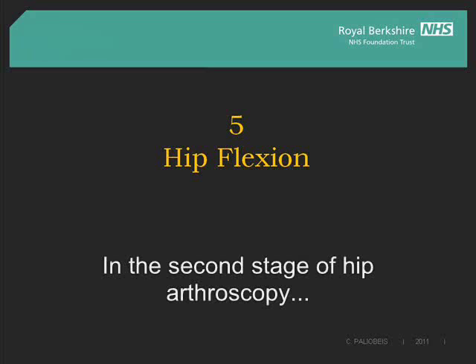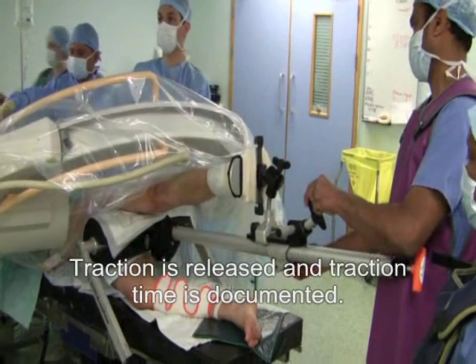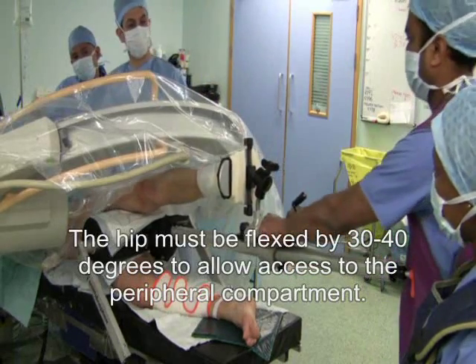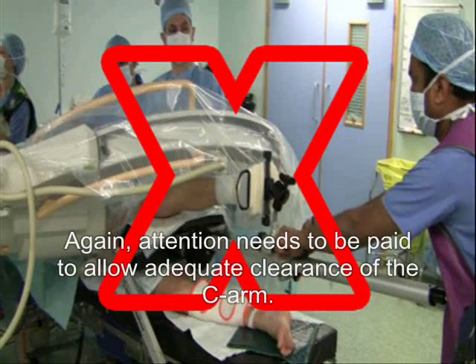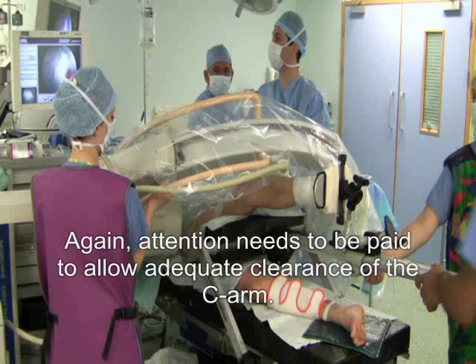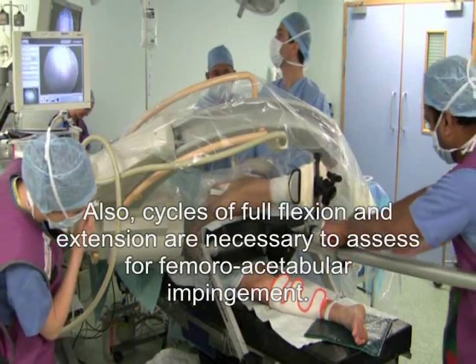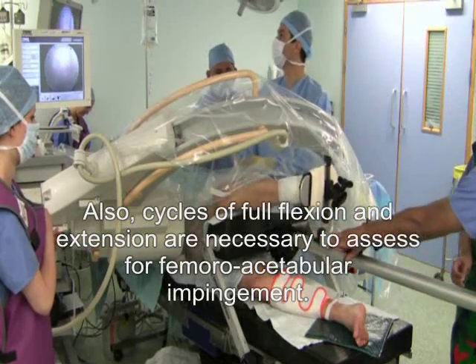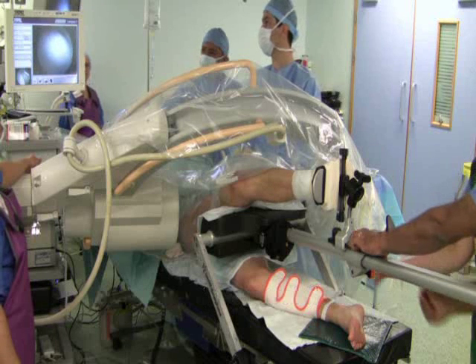In the second stage of hip arthroscopy, traction is released and traction time is documented. The hip must be flexed by 30 to 40 degrees to allow access to the peripheral compartment. Attention needs to be paid to allow adequate clearance of the C-arm. Cycles of full flexion and extension are necessary to assess for femoral acetabular impingement, and back to neutral flexion.